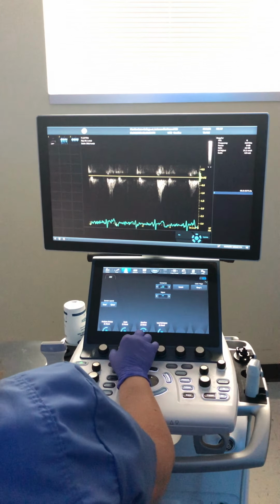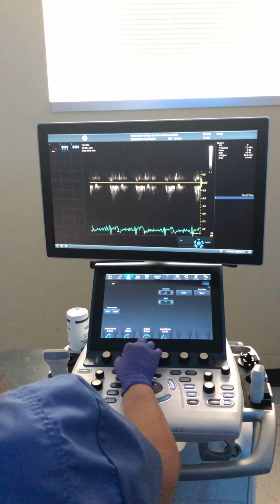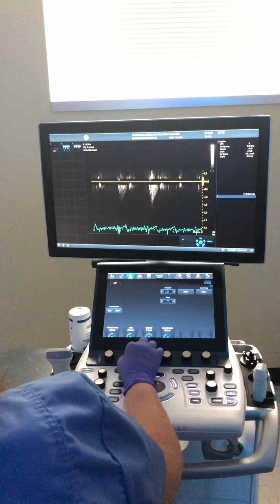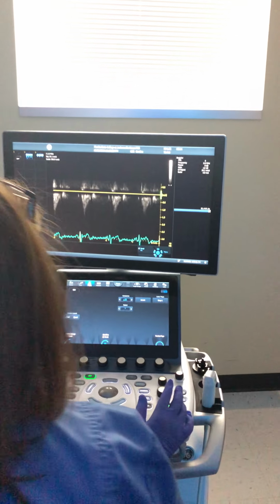Okay? See how it's getting different? So take a small breath in. Okay, blow your air out. Hold it, hold it, hold it, and breathe. All right, so I'm gonna store that.